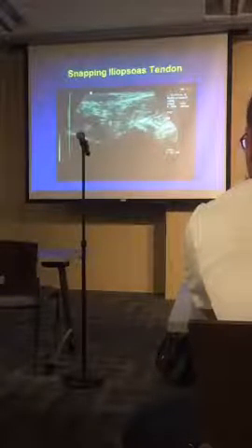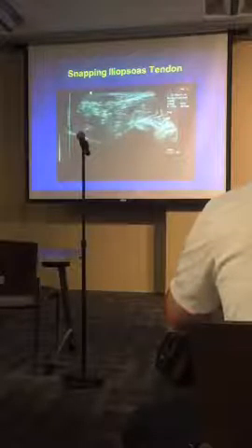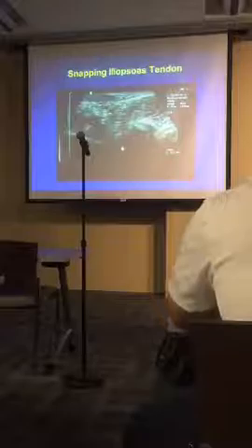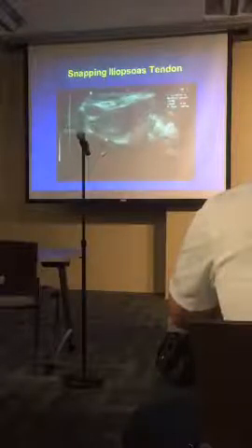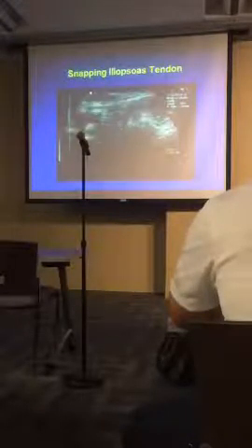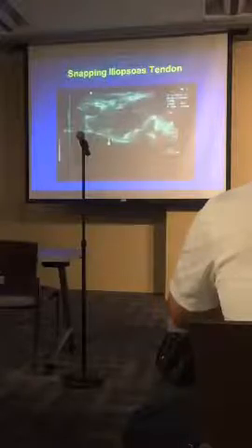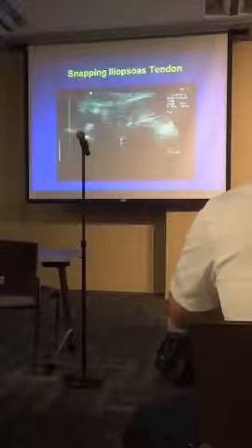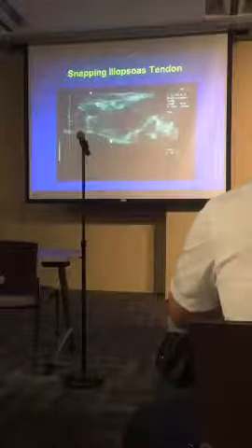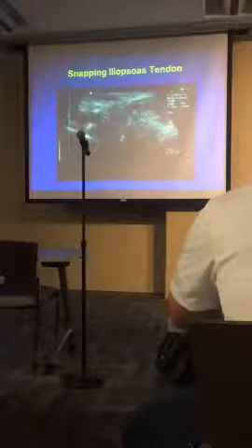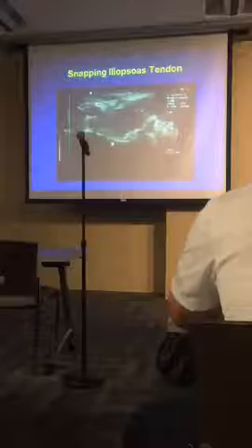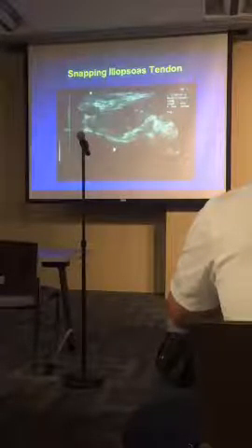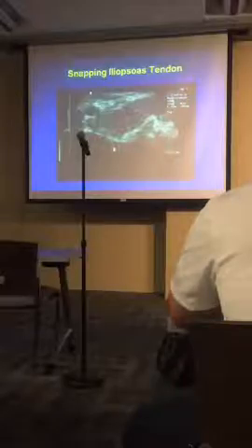In snapping hip, with the patient's iliopsoas tendon, neurovascular bundle visualized, we have the patient reproduce the click by flexing and extending the leg — and at the end of the motion, the iliopsoas tendon clicks against the bone. You can feel it against your probe and see it on the screen. In a young soccer player with peroneal tenosynovitis on MRI that didn't explain why she couldn't walk: at rest the peroneus longus and brevis looked only mildly abnormal, but with movement, half the peroneus brevis goes over the bone, the other half stays behind, and the tendons are unstable. A static image would not have revealed the severity of this pathology — she required major reconstructive surgery.